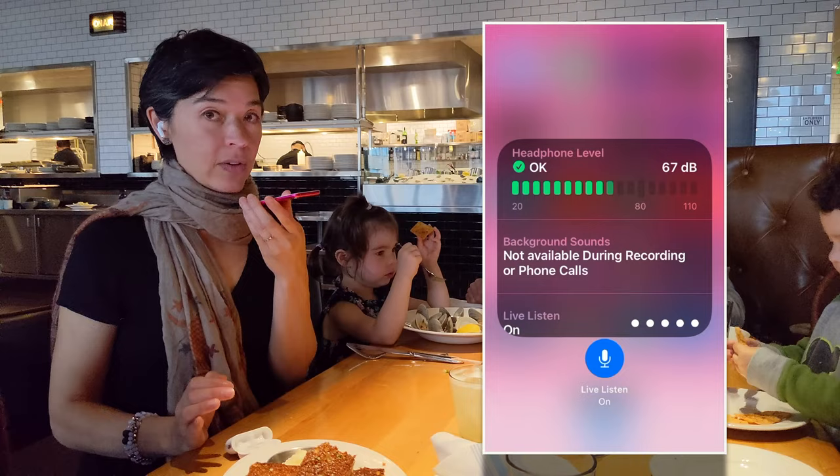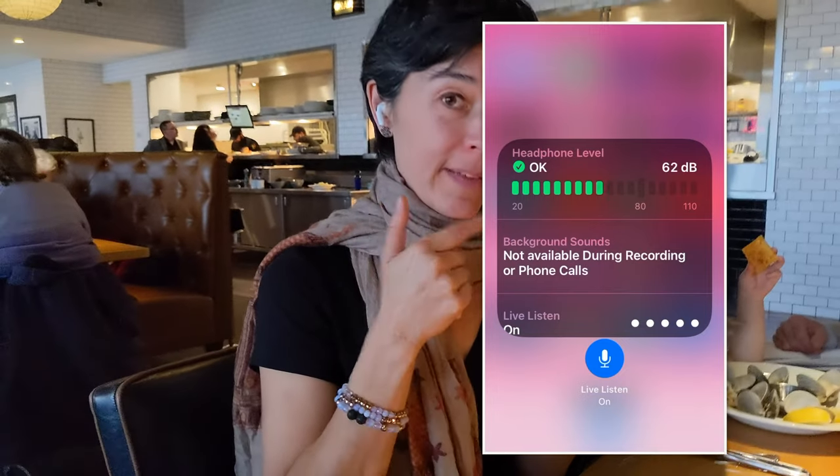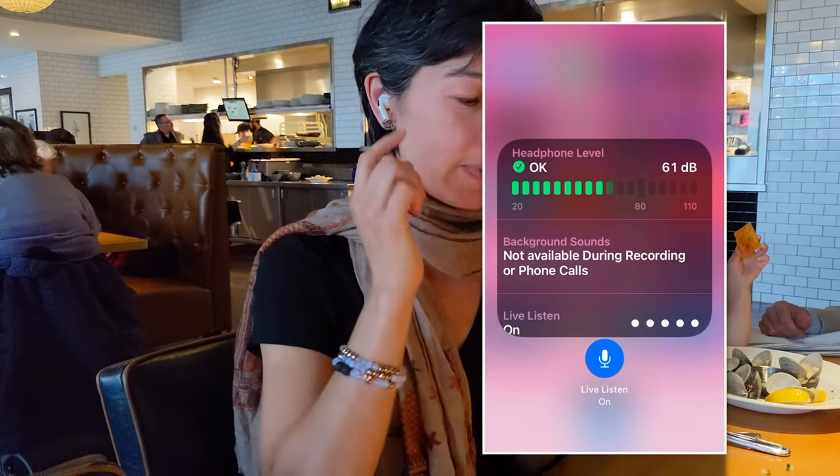I've turned on Live Listen now, so my iPod is picking up my voice and sending it straight to my AirPods Pro.